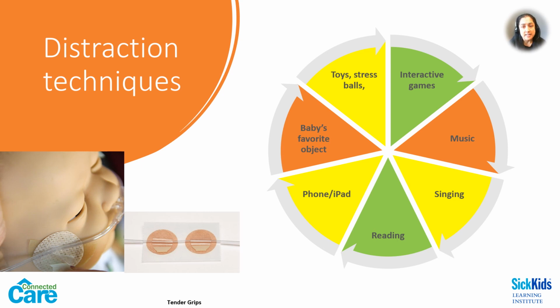products such as Tender Grips, as seen here, and Easy Hold tabs are another brand commonly used by our families. These products not only secure the prongs to the face, but also prevent skin irritation when they're having to adjust or change out the prongs.